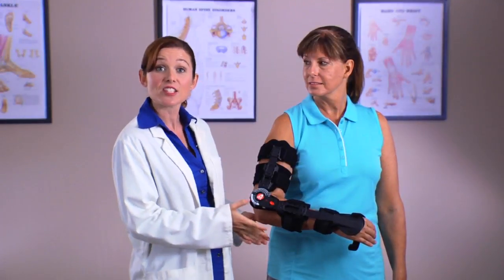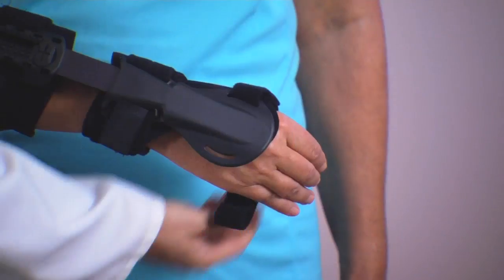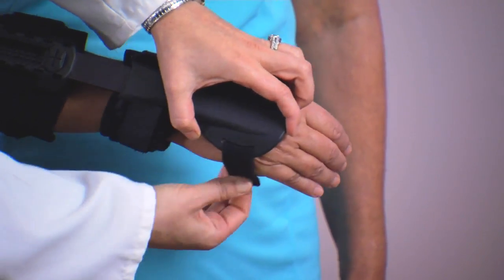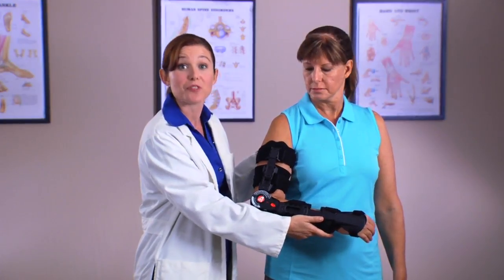Finally, with the T-Scope Elbow Premier Brace properly applied to the affected arm, wrap the strap on the Neutral Hand Accessory around the hand. The hand and wrist are now secured and pronation and supination will be reduced.